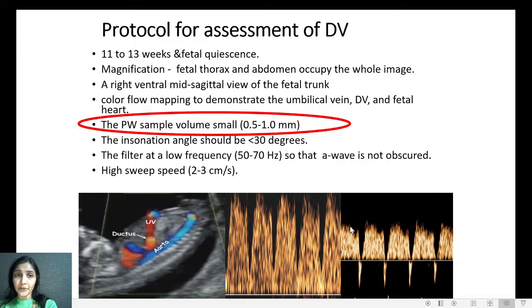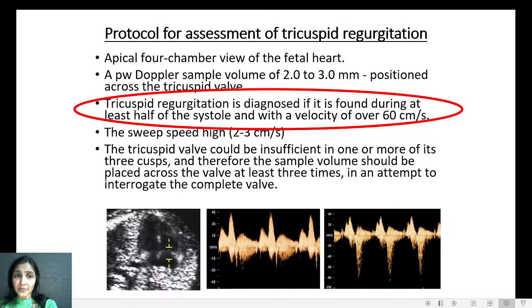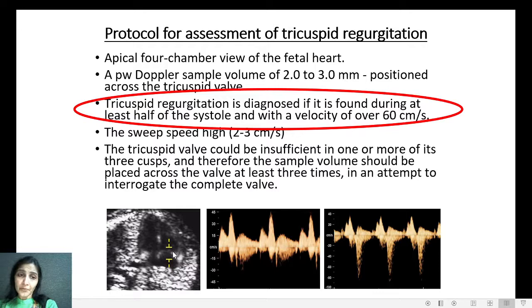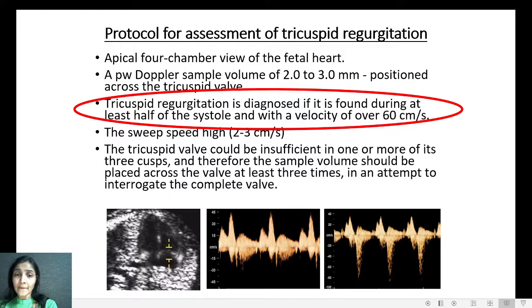Coming to the protocol for assessment of tricuspid regurgitation: we should get a magnified apical four-chamber view. The Doppler sample volume should be between 2 mm to 3 mm to include all the cusps of the tricuspid valve. The sweep speed should be high. If we are able to get velocity scales more than 60 cm per second below the baseline covering more than half of the systole, then tricuspid regurgitation is considered present and is a marker for aneuploidy.